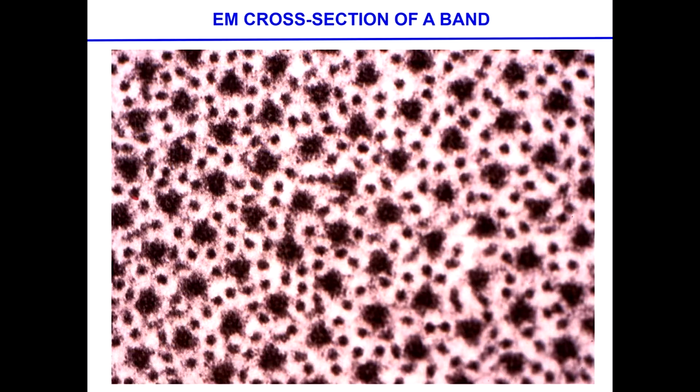It's the disorganization in some parts of the slide. But this is what you will see in what kind of region? In the region where there is overlap between the two filaments, the myosin and the actin. Okay, questions?